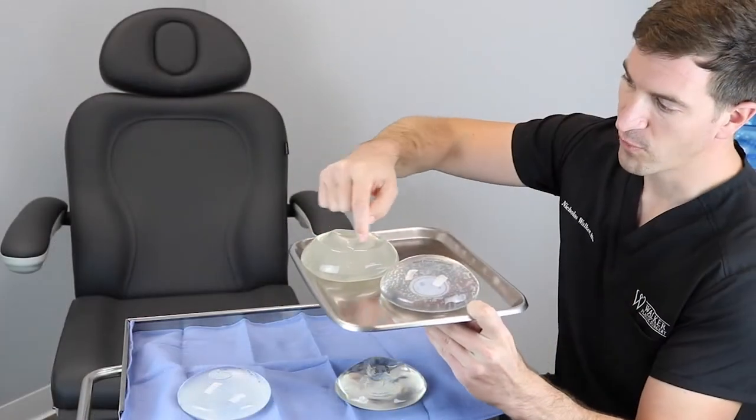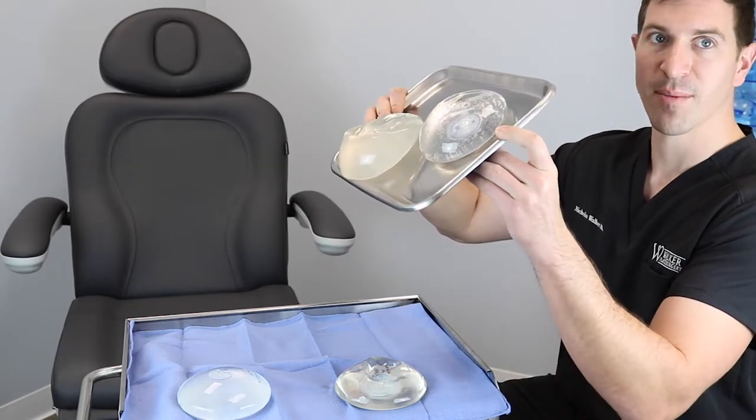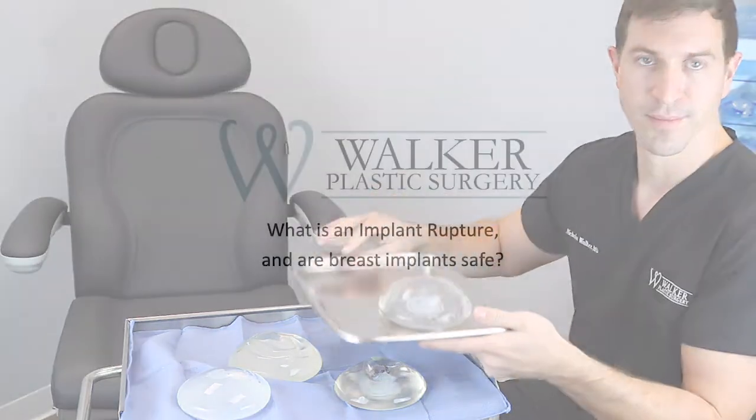This implant is going to deform much more — this one has the old runny silicone in it, and if you start turning it you can see how much more that implant deforms; it'll just fall right off the table. So let's cut them all open and see what's inside.